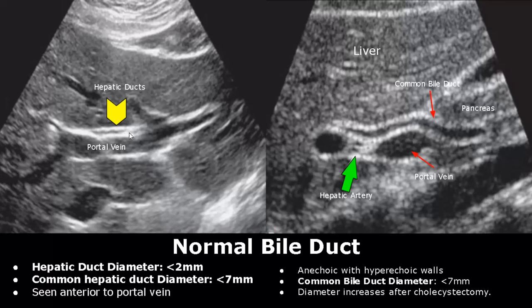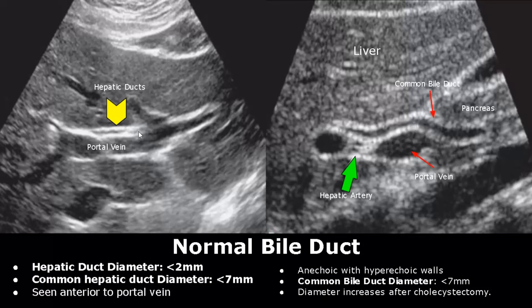The right and left hepatic ducts join together to form the common hepatic duct. Then the cystic duct, which comes from the gallbladder, joins the common hepatic duct to form the common bile duct. The hepatic duct measures less than two millimeters in diameter. The diameters of the common hepatic duct and common bile duct are variable, but a value of seven millimeters has been used for normal values in recent years.